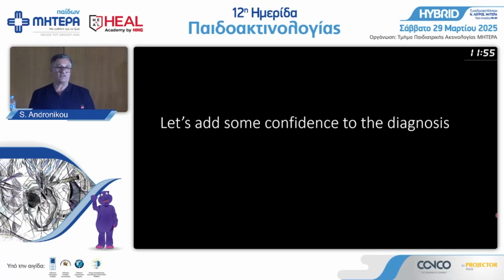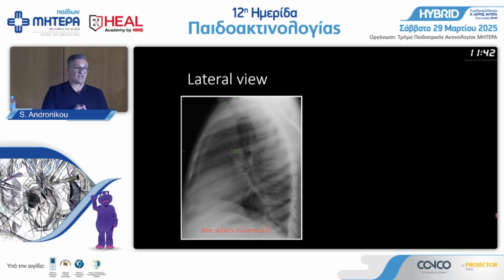But if you're here and you have a couple of migrants and they say, oh, we think the patient just came from Malawi with the parents and everybody's sick and the mother's positive, you can use your cross-sectional. It's one patient, you know. So use the lateral film.